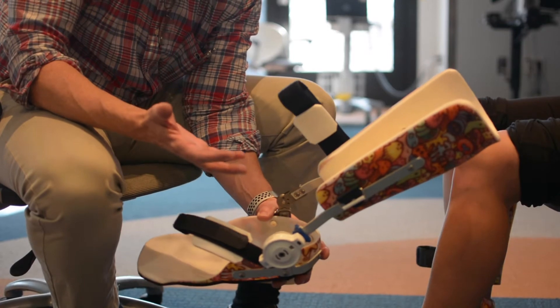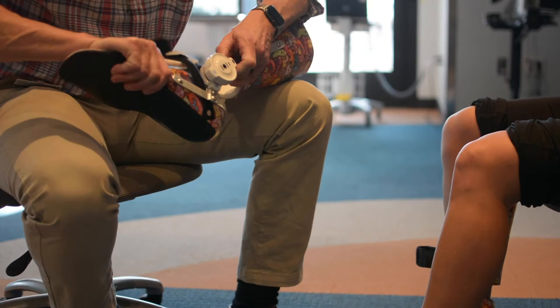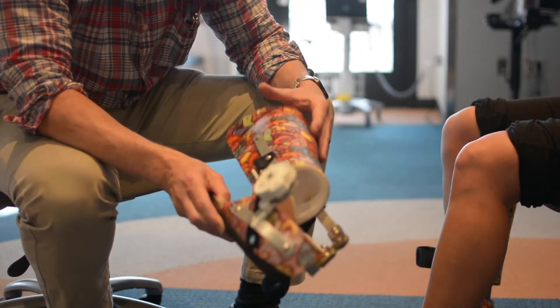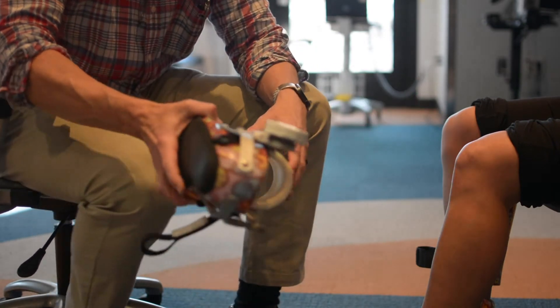But let's say you accidentally took it off — no big deal — and you forgot to lock it. So let's say you went to take that off and it went like that on you. It's still no big deal because you're just going to do the process all over again of getting it back into position.